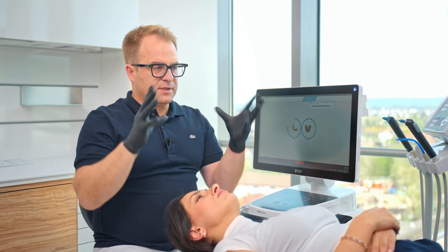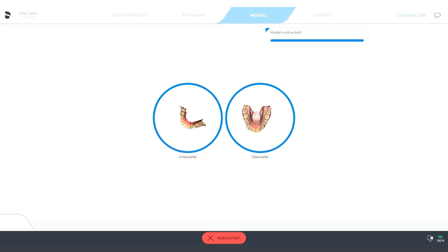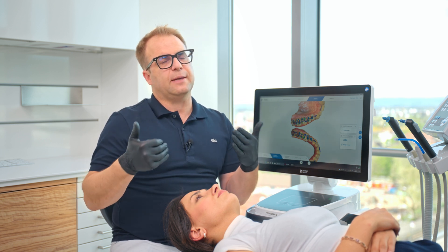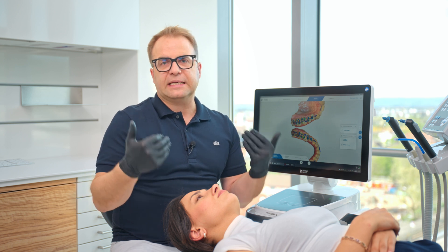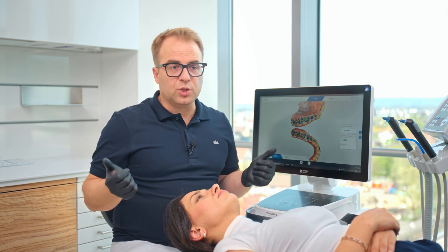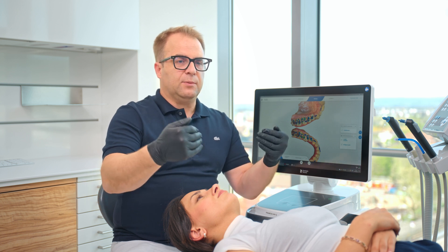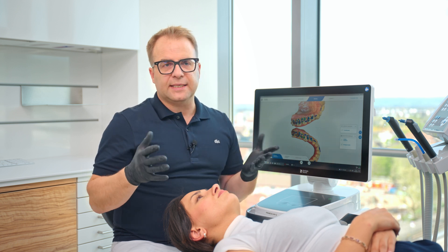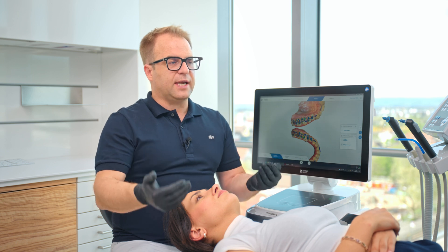The computer is now calculating the models based on the scans — the whole three-dimensional object and their position in natural occlusion. When you want to increase the vertical dimension of the occlusion, for example in a bite lift, for a splint, or a new occlusal position, you can add something between the teeth — like a deprogrammer, a jig, or a wax plate — and then rescan the bite from the side with this object between the jaws. The scanner will then calculate the new position.